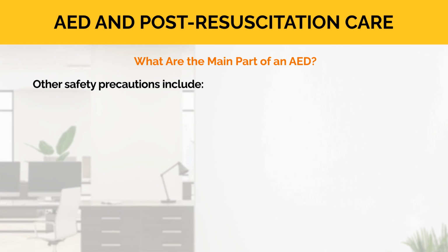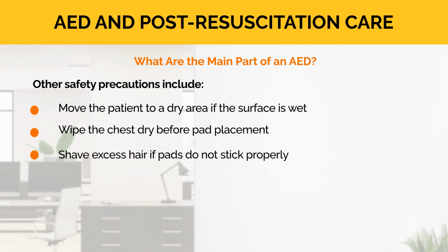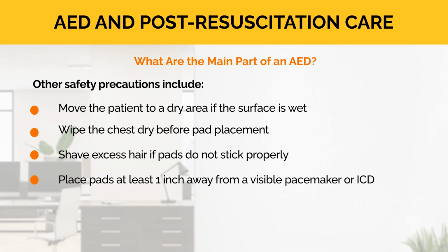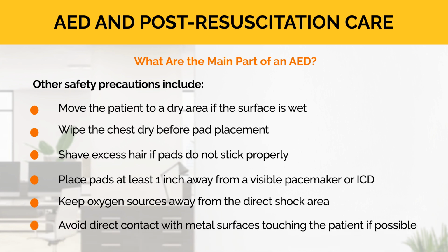Other safety precautions include: move the patient to a dry area if the surface is wet. Wipe the chest dry before pad placement. Shave excess hair if pads do not stick properly. Place pads at least 1 inch away from a visible pacemaker or ICD. Keep oxygen sources away from the direct shock area. Avoid direct contact with metal surfaces touching the patient if possible. Note: always say "clear" before shock delivery and visually confirm that nobody is touching the patient.